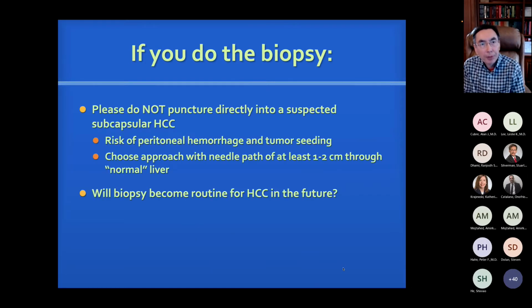If you do a biopsy for HCC, please remember to do everything you can to avoid puncturing directly into a subcapsular HCC tumor. That's going to increase the risk of not only bleeding complications, but tumor seeding. Instead, try to choose an approach where the needle goes through at least 1 or 2 centimeters of uninvolved liver.